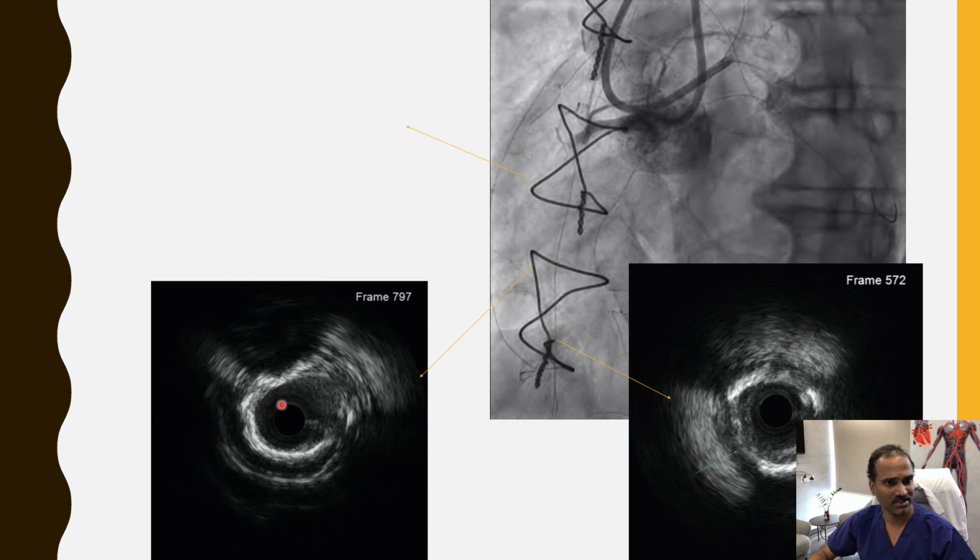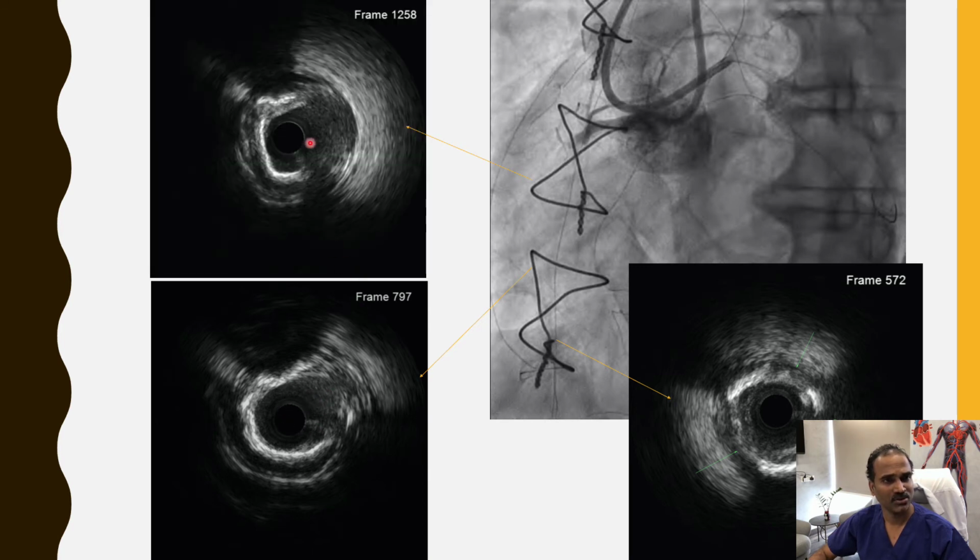You can see here it's in the true lumen. So clearly the knuckle went through the true lumen and reached the true lumen. There is no subintimal entry in this case. That can happen in a few of the knuckle wiring cases. Especially, I think retrospectively in this case, as the CT showed, calcium is within the wall and almost circumferential.